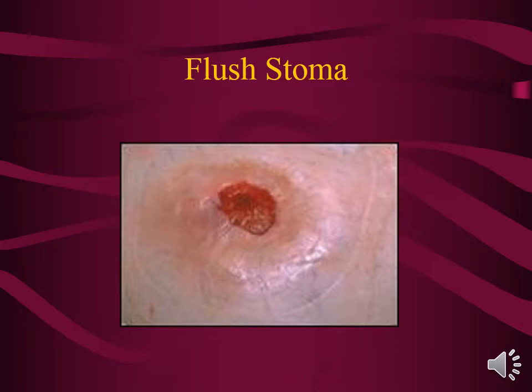The reason that you would go from one piece to two piece, and I know that they say this in Hollister, is that the one piece is nice and flat, and so people like that, not being able to see it under the clothing. But the idea of having the two piece is that you can switch parts in and out, and so that's a really nice, convenient thing for patients as well.